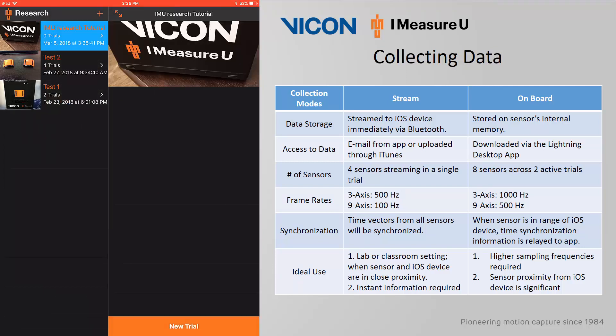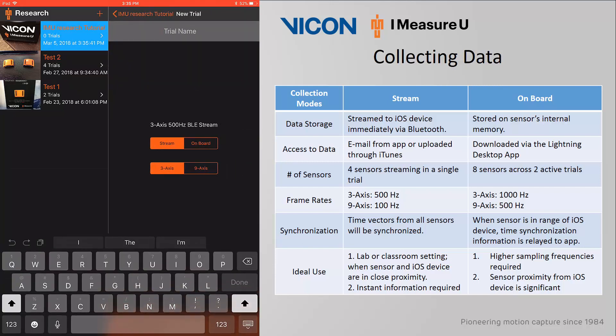Now highlight the session you want to use. Click New Trial at the bottom, and then at the top you will be prompted to enter a trial name — I will type in Trial 1. Below you will have two options for how you want to collect your data. I have summarized these options on the right to help you choose which mode is best suited for your application.